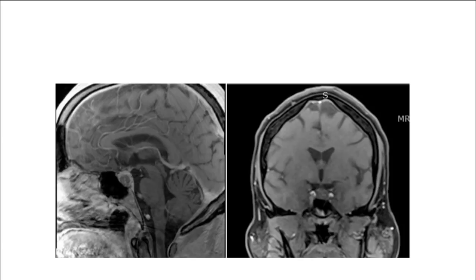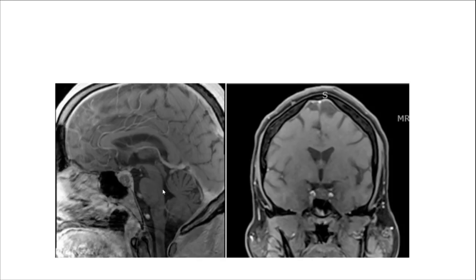And here's the MRI again, sagittal, a T1 post-contrast, and then a coronal. If you see here, this is the lesion. This is your sphenoid sinus here, your clivus. Something that's very typical, if you see in the brain, most of the lesions that you encounter are described as enhancing. That's something that allows you to recognize many of the pathologies that you see in the brain. In the pituitary, actually, the normal pituitary is the one that enhances usually. As I showed you, it has a very dense capillary network. So many of the adenomas are described as non-enhancing. That's what allows you to recognize them.